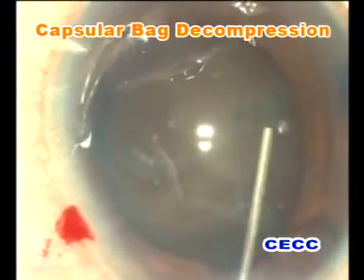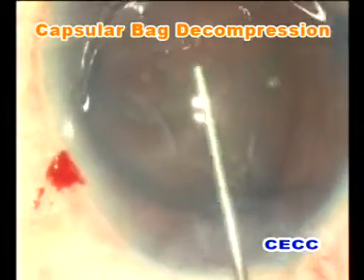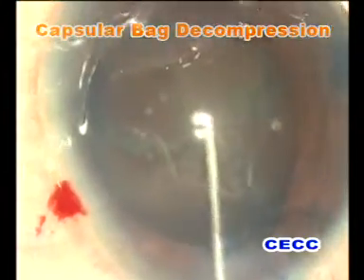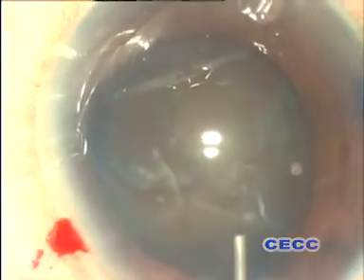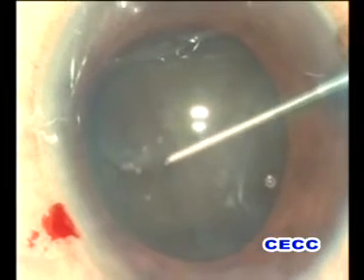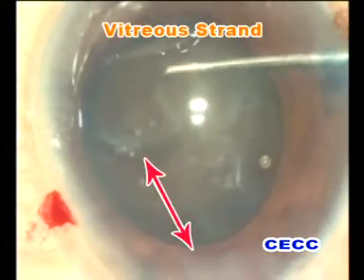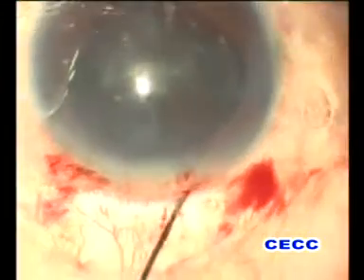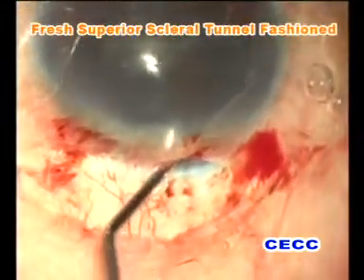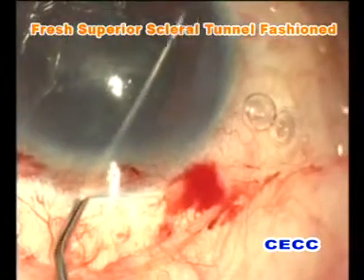Pupillary peaking was noticed in the sub-incisional area even before any attempt was made to rotate the nucleus. Since the pupillary peaking was detected early, nucleus rotation was not attempted at this moment. Thinking that pupillary peaking was a result of vitreous presence in the anterior chamber, we wanted to perform a confirmatory test. A Sinski hook was swept away from the incision and paracentesis sites to look for vitreous strands, which were indeed confirmed.